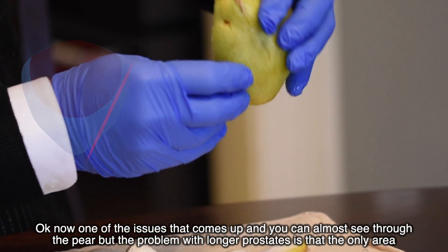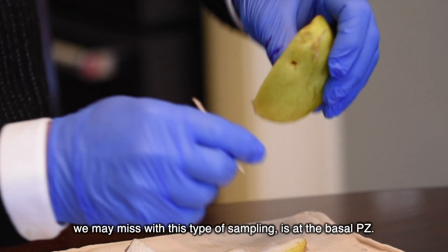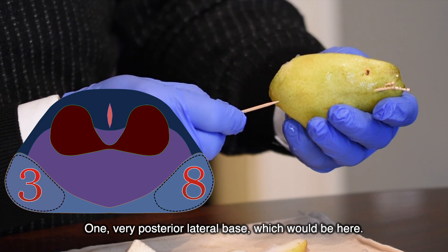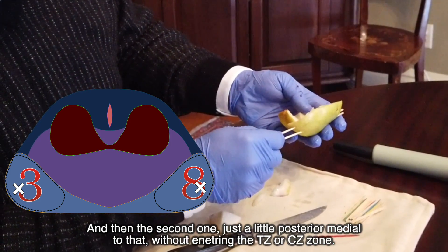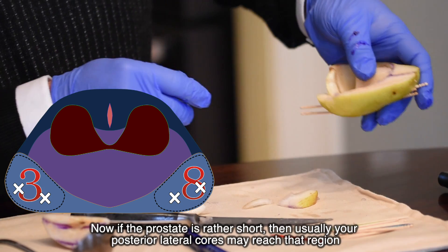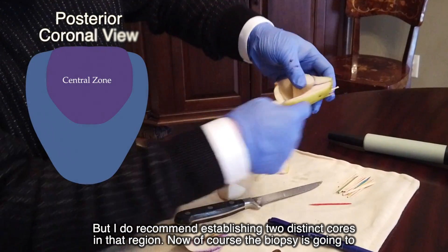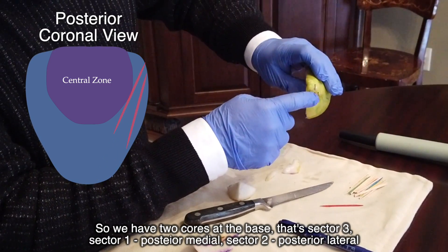The fourth sample rides up the anterior horn, staying close to the lateral posterior capsule — that's number two in the posterior lateral segment. For longer prostates, the area we may miss is the basal PZ, around where the seminal vesicle comes off. I recommend taking two cores: one very posterior lateral base, and one just posterior medial to that without entering the TZ or CZ. If the prostate is short, your posterior lateral core may reach that region, but I recommend two distinct basal cores.